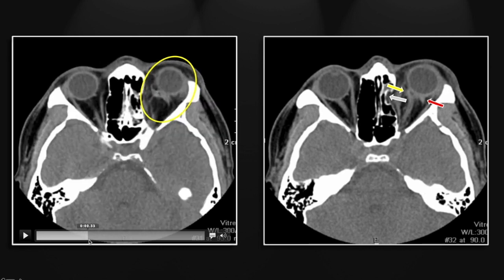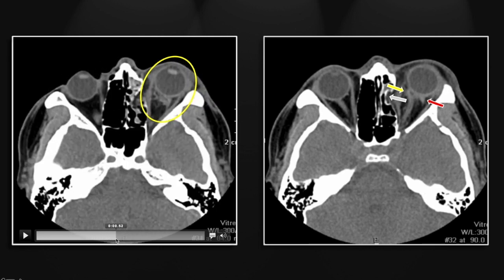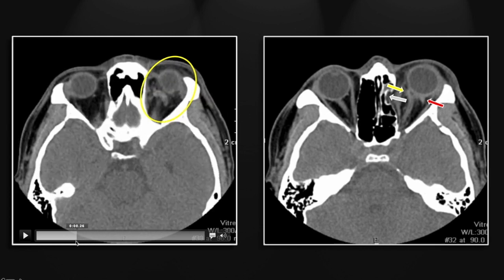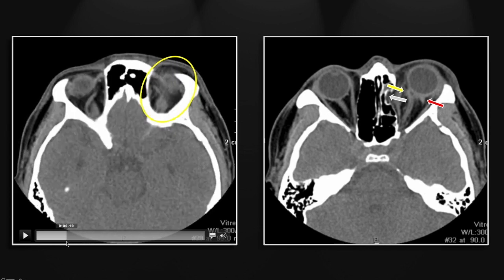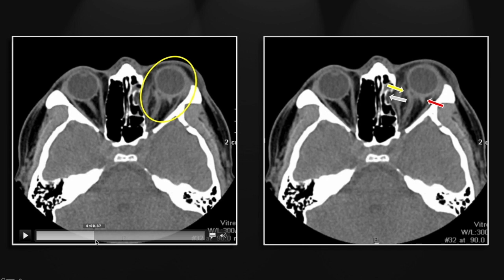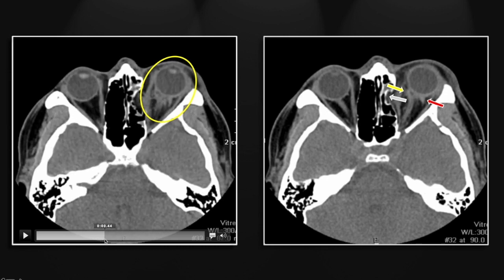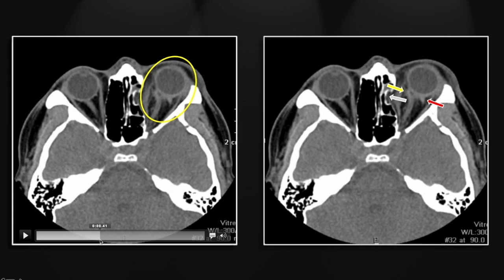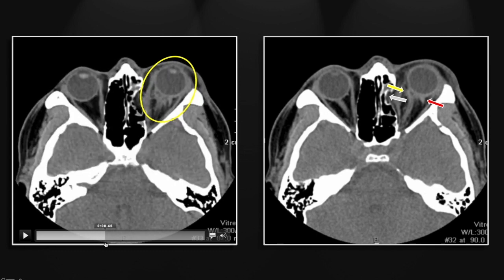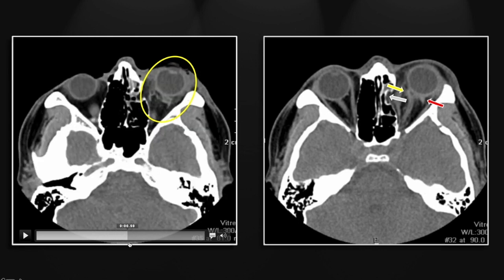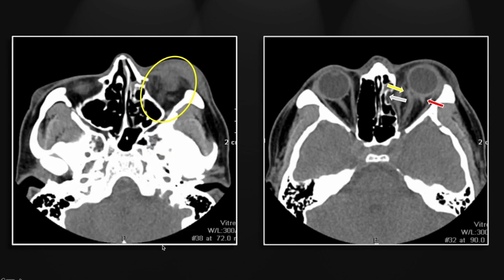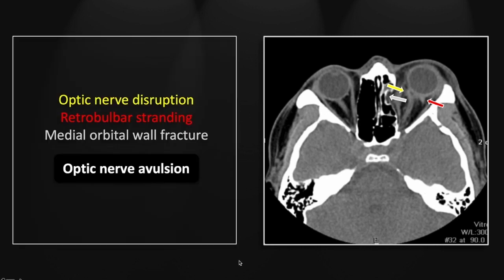Going top to bottom, there is stranding and density ascending to the superior aspect of the orbit. Right there you can see the optic nerve is displaced medially from where it should be inserting on the posterior aspect of the globe. That is a case of an optic nerve avulsion.